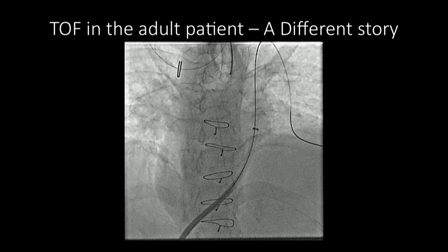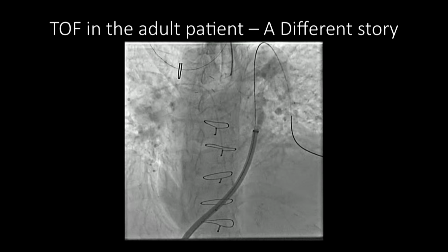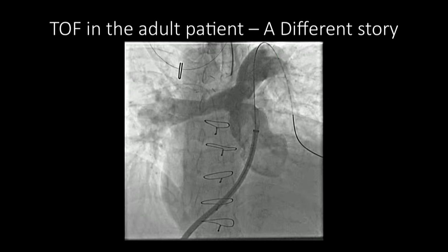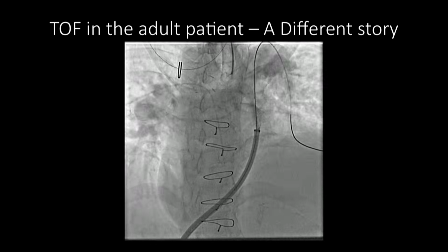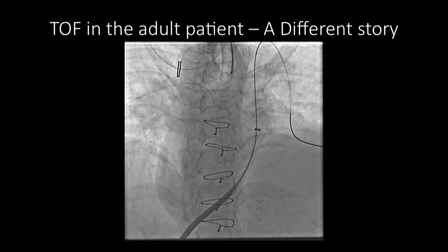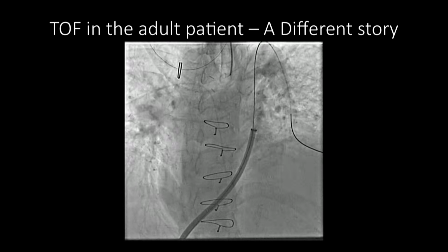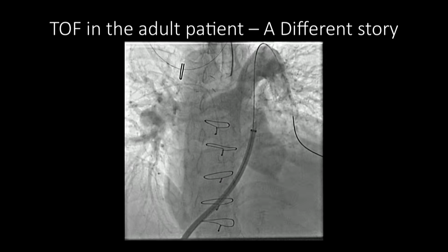So to have a complete story of this patient that we were looking at by MRI with pulmonary regurgitation, echo and then MRI, here is an angiogram. We're injecting in the pulmonary artery, and we can see how as the contrast gets injected in the main PA, the right ventricle receives flow. And it's early, it's short, and also in physical exam, the PR murmur is early, short, and unimpressive.